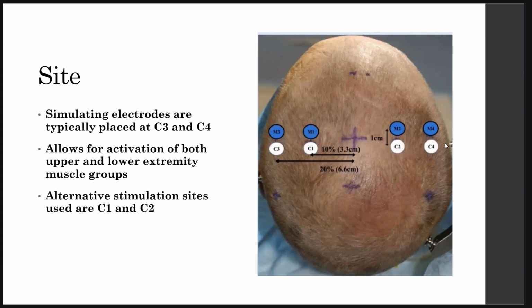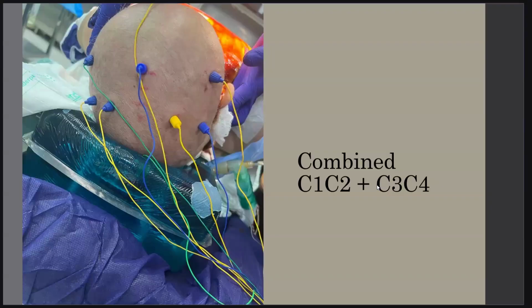We can use it in corticobulbar evoked potentials when we take the CZ to C5 montage. But it is better to take all 4 points and then manipulate according to the responses you get inside the operation in order to get a better response, more waves, more potentials, and better analysis and better decision making. So this is according to 10-20. The patient is prone, the anterior part, and the lower 4 electrodes, C1, C2, C3, C4. You record it, you point it, you measure it, and then in the operation, what you get.